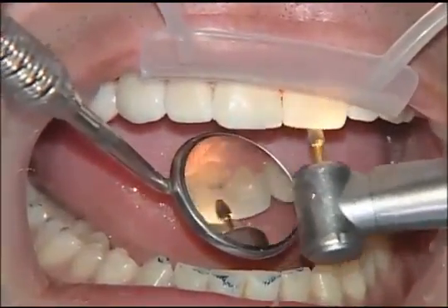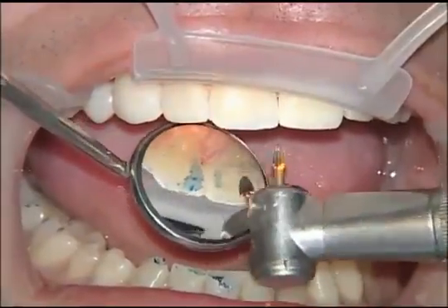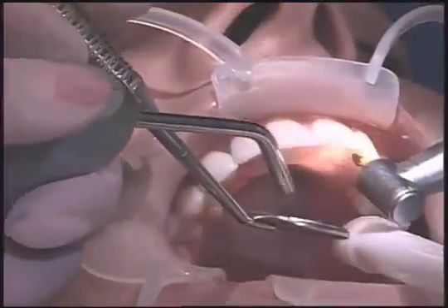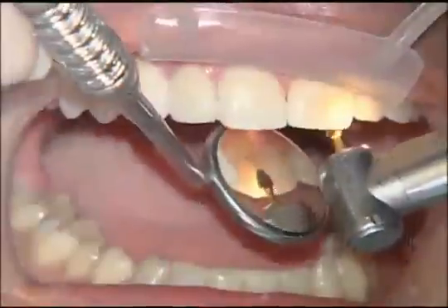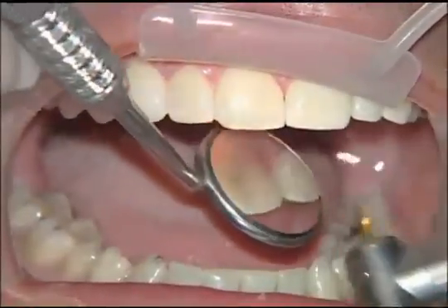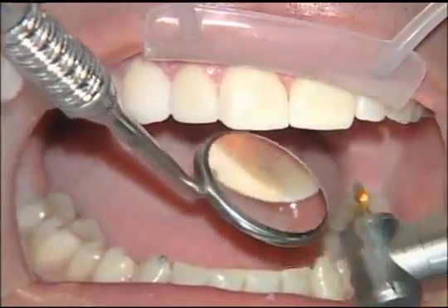So we use the 7408 to not only remove any excess cement, but to take care of any excursive areas that we want to remove from the ceramic material, or in fact if we do have a high spot. The 7408 at relatively slow speeds does a good job of removing ceramic material without causing a lot of the roughness that you can have with something like a diamond. If I'm going to use a diamond for this purpose, I will use a very fine diamond, like a 30 micron diamond football burr.